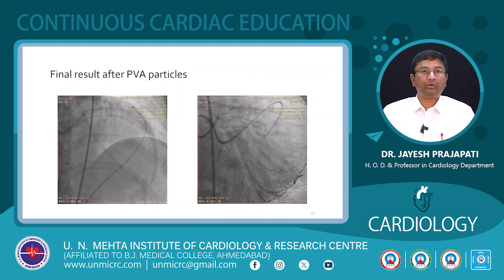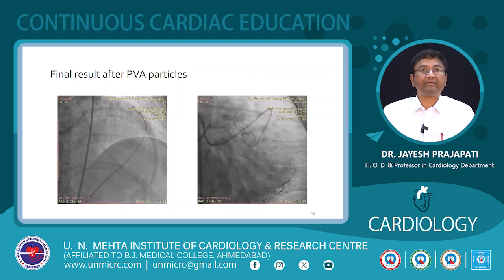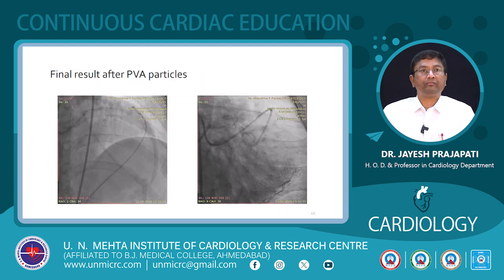we put a microcatheter over that wire. We have a vascular interventionalist in our lab. They have PVA particles, cheap things. So we put the microcatheter in and pushed the PVA particles inside, and we were able to stop that. So see, these are the PVA particles, and we were able to stop that.